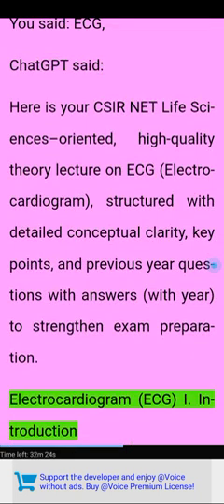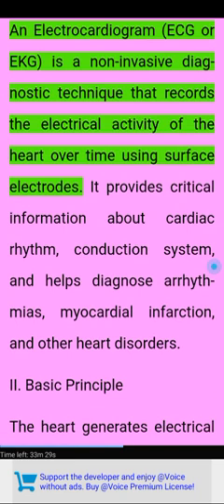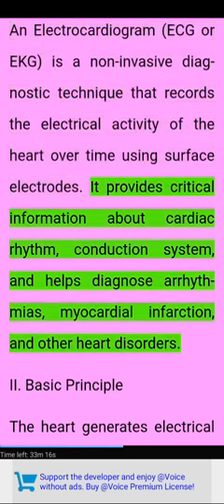Electrocardiogram, ECG, introduction. An electrocardiogram, ECG or EKG, is a non-invasive diagnostic technique that records the electrical activity of the heart over time using surface electrodes. It provides critical information about cardiac rhythm and conduction system, and helps diagnose arrhythmias, myocardial infarction, and other heart disorders.